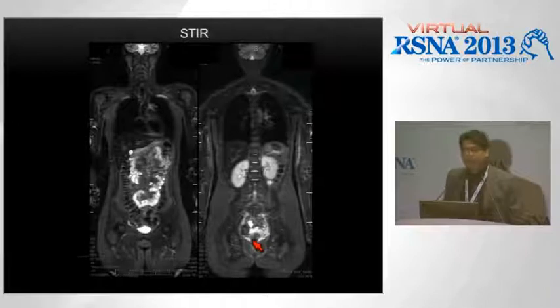So these are typically how the whole body STIR sequences on our scanners look like, where the coverage is really from the base of the neck all the way down. And you can see you get excellent tissue contrast. The intra-abdominal structures are very well seen. And when we use respiratory compensation techniques, which we've started to do in pediatrics, even the evaluation of the lungs is fairly good.